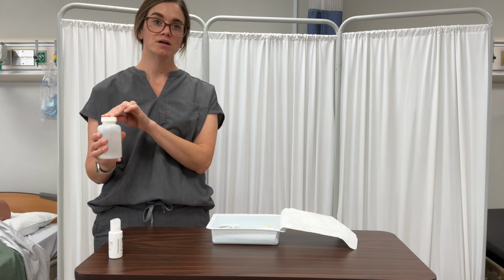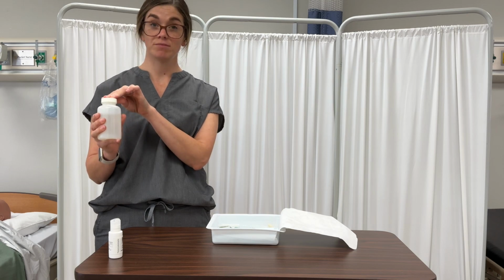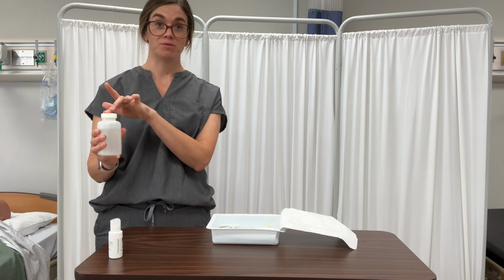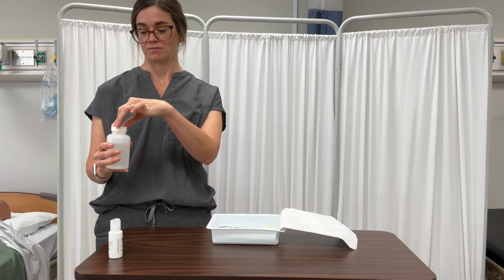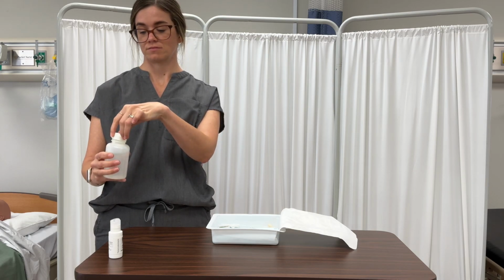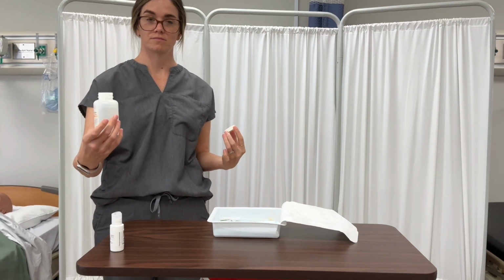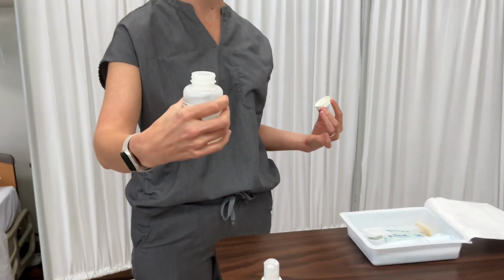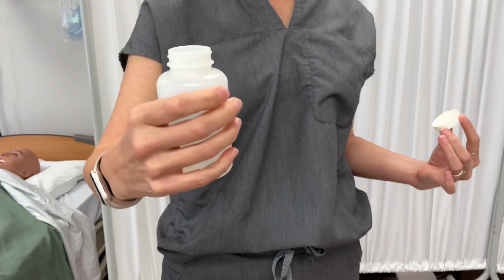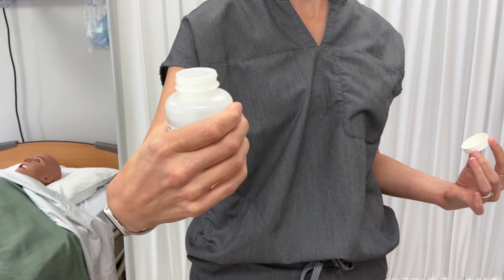If your liquid is brand new and hasn't been opened, you do not have to lip it. If the bottle has been previously opened, you have to lip the solution into a waste receptacle while turning the bottle one full turn. I'm also going to use my palm to cover up the label, just to make sure that any contaminants from the label will not get on anything.